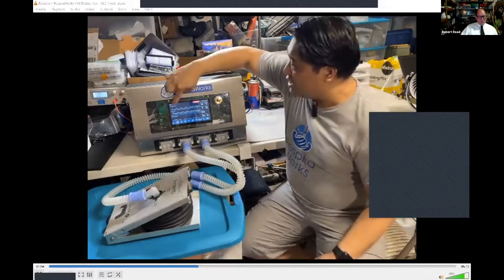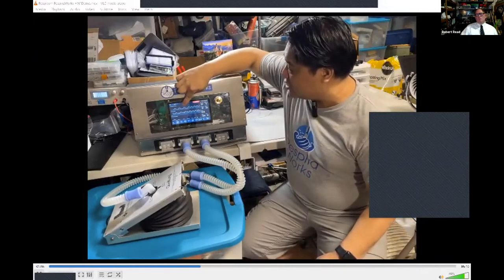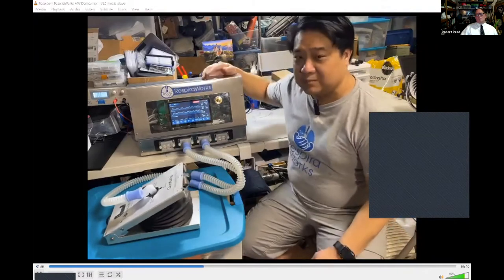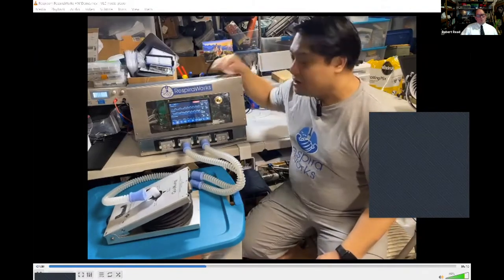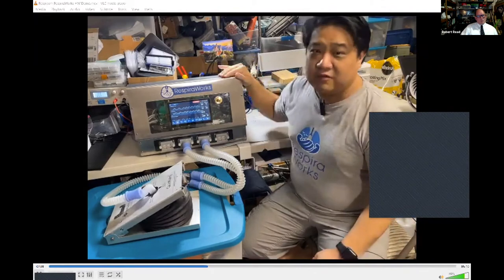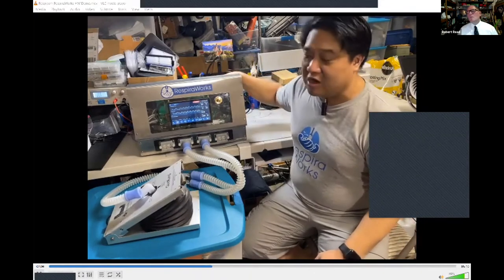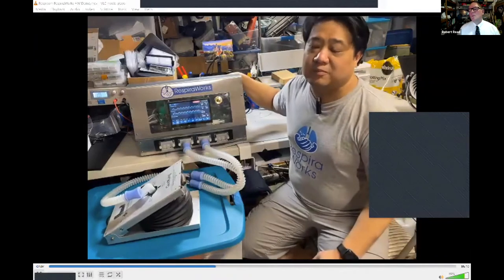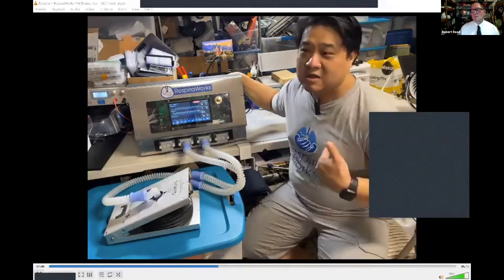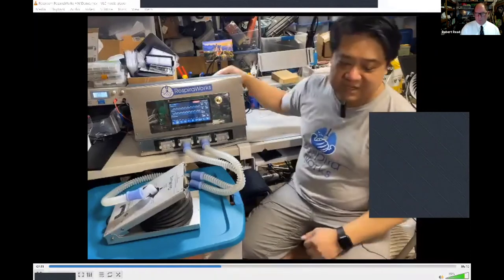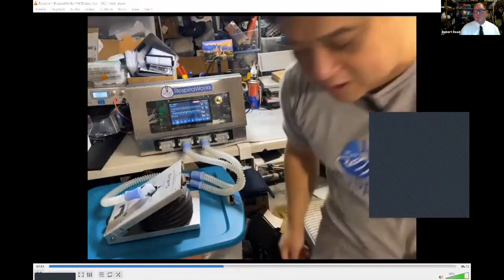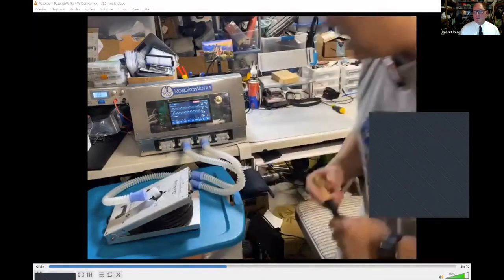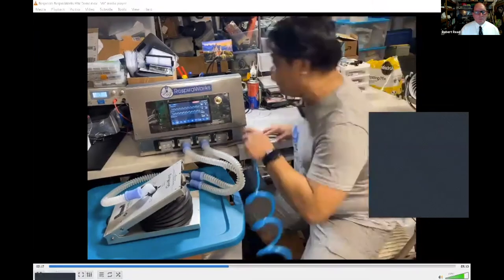And you get a live readout of the pressure, flow, and tidal volume that's being delivered to the patient. Now, if the patient requires supplemental oxygen, the ventilator is also capable of controlling off a standard pressurized hospital oxygen supply at 50 psi. So we actually have a compressed air tank here to act as a stand-in, and I'll go ahead and connect that now.